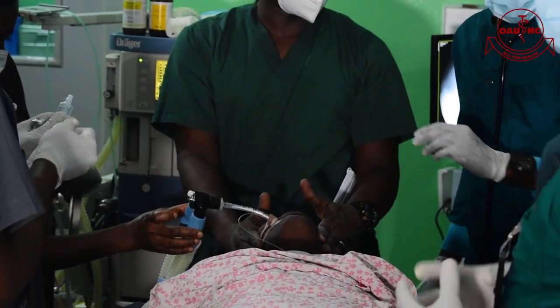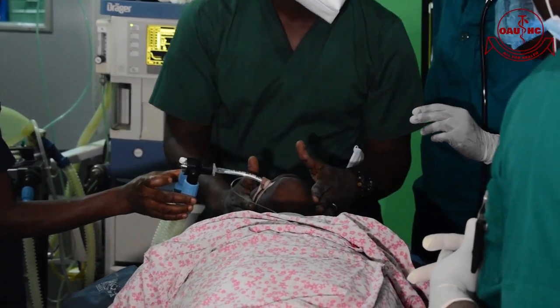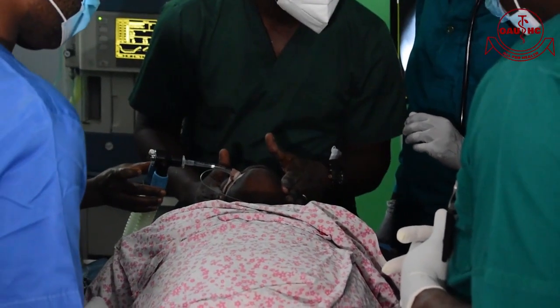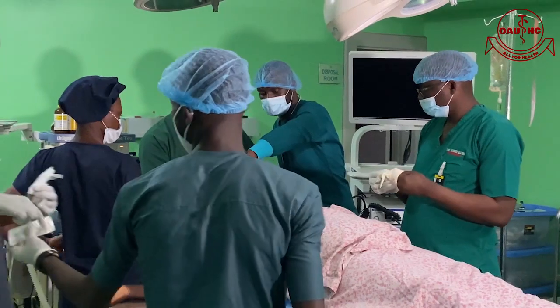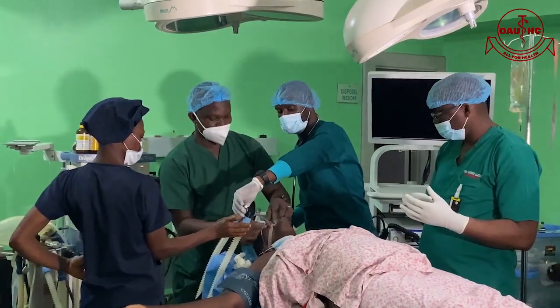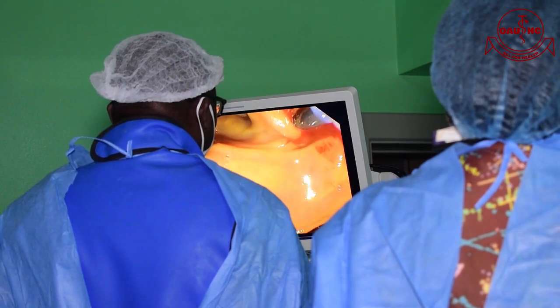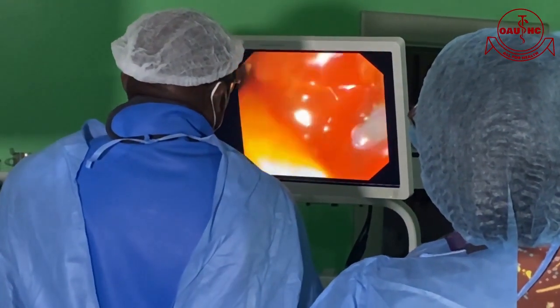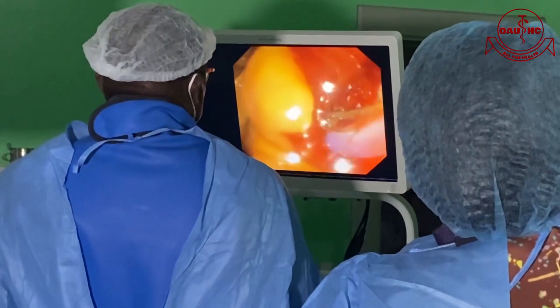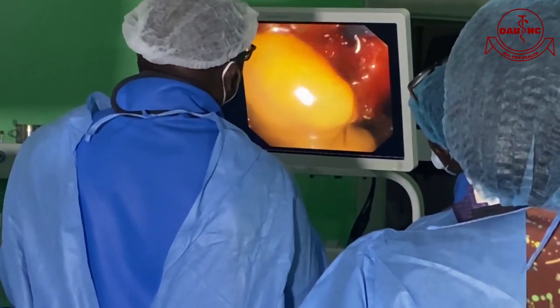ERCP is performed under general anesthesia. The patient is put on the bed and put under anesthesia that will make them sleep. After the patient is asleep, we position the patient in what we call the semi-prone position, and then we pass the endoscope through their mouth right into their duodenum, the second part of the duodenum. We face the ampulla and then use what we call sphincterotomy and a guide wire to enter into the common bile duct, and then decide from what we can see on the X-ray machine.